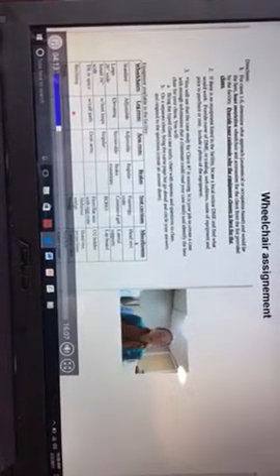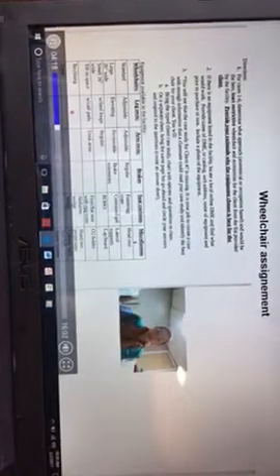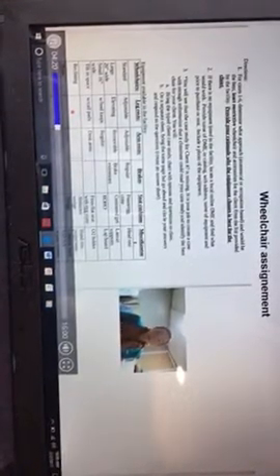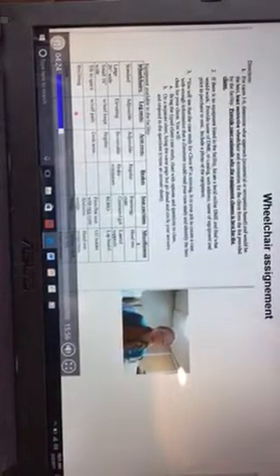So especially if you have somebody who has just had a hip replacement, doesn't have a lot of muscle control, then that foot's going to fall off. So you really don't ever want to do an elevating leg rest with the intent of elevating without heel loops and calf pads.